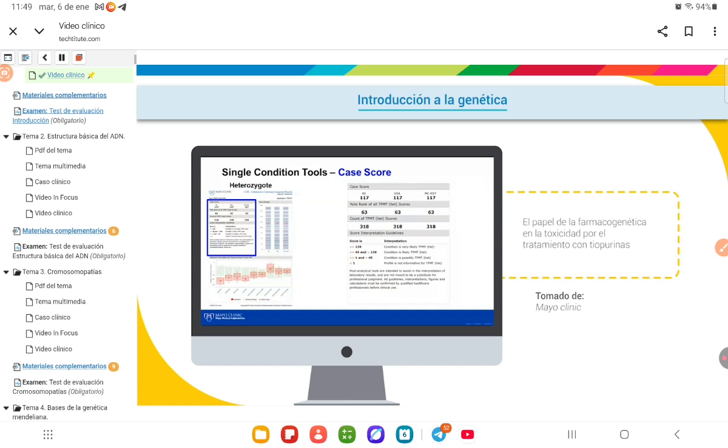The values in these reports are identical because only our lab has contributed data so far. The score interpretation guidelines correspond to the first, 10th, and 25th percentile of the scores for confirmed heterozygous cases, but these can be modified also as desired, and any test can be customized as well. The rationale to display 3 scores will be explained in more detail in the next slide.